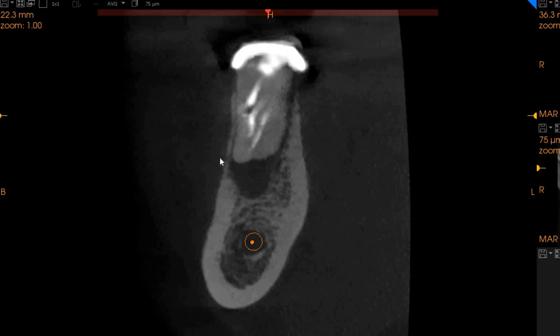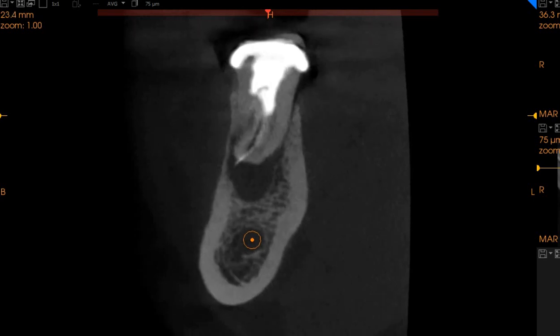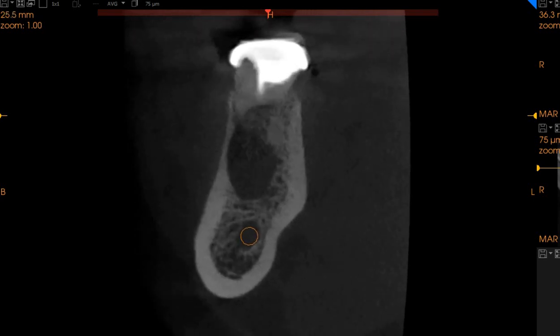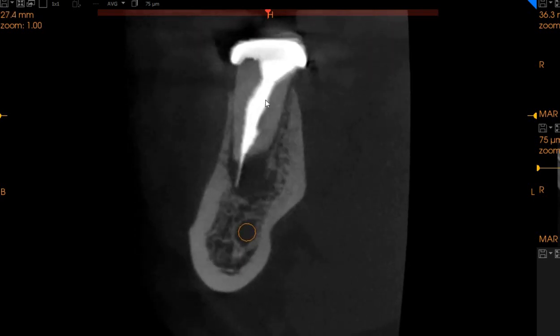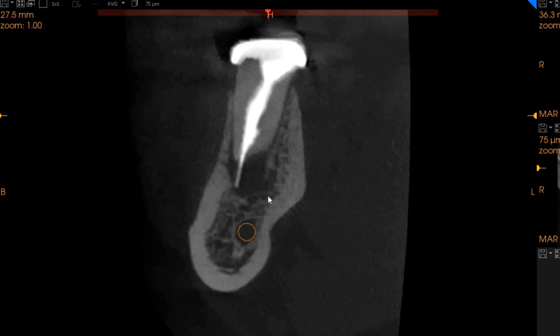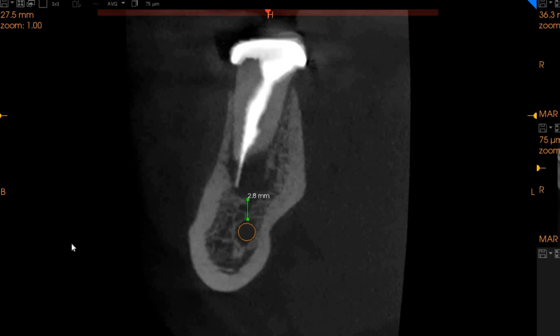The cortical plate on the lingual side is intact, whereas the cortical plate on the buccal side is very thin, but however it is intact. This is the interradicular area, and this is the distal root where we can see over-obturation, and we can also see a radiolucency which is approximately 2.8 millimeters from the inferior alveolar nerve.